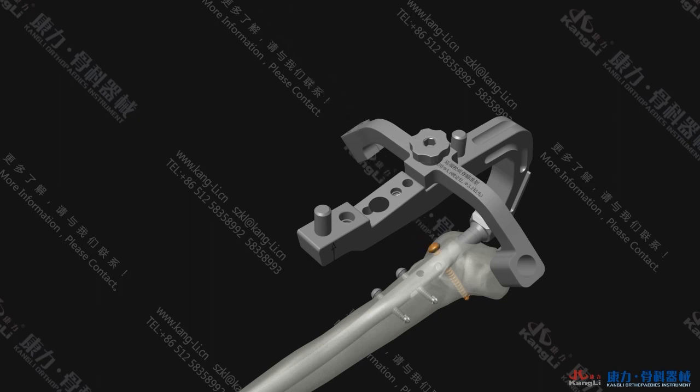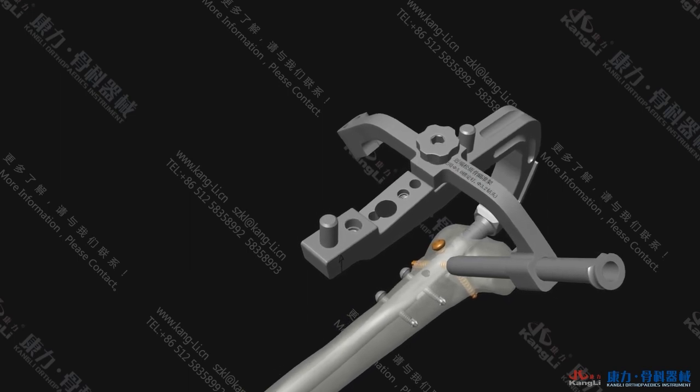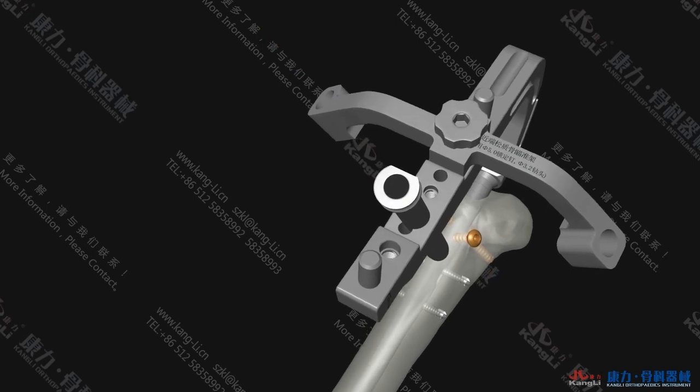Repeat the above steps to finish the placements of the 2nd and the 3rd 5.0 locking screw for the oblique as well as the front and rear positions respectively.